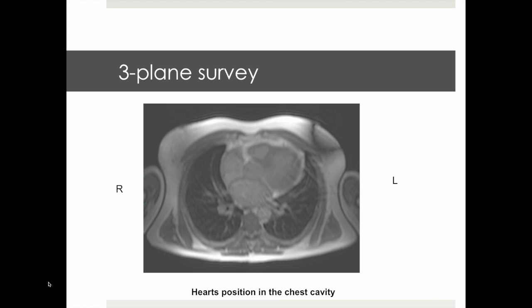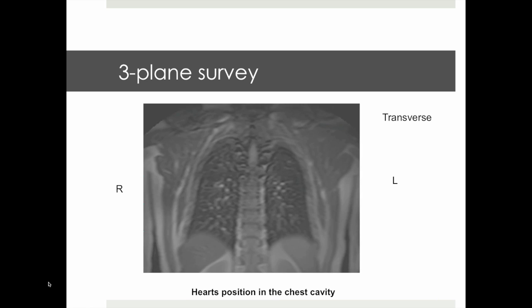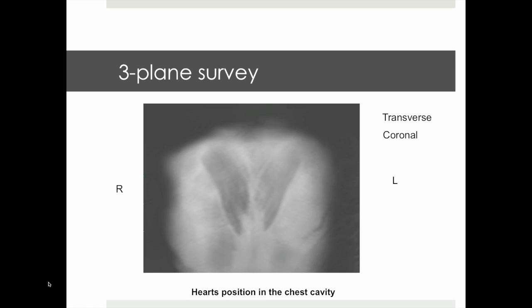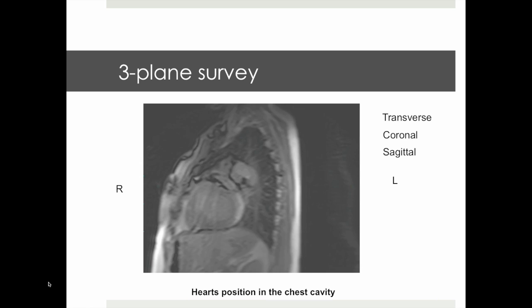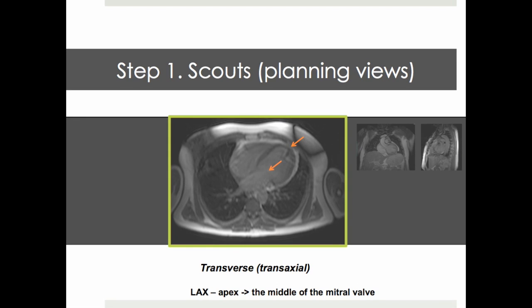The triplane survey serves to identify the heart's position in the chest cavity — in transverse, coronal, as well as sagittal orientation. We begin with a transverse view, in which we see most of the left ventricle, mitral valve and left atrium. We place our first imaging slides in line with the definition of the long axis of the left ventricle, which connects the apex and middle of the mitral valve.